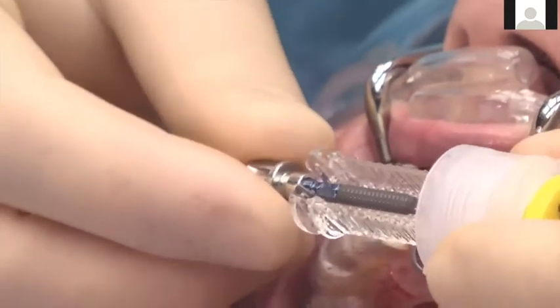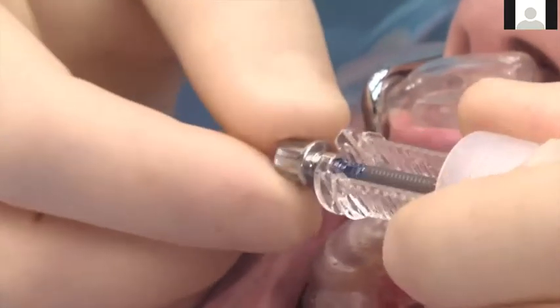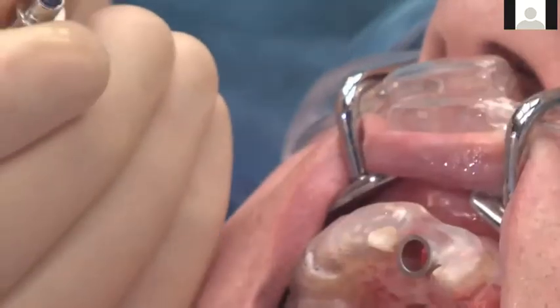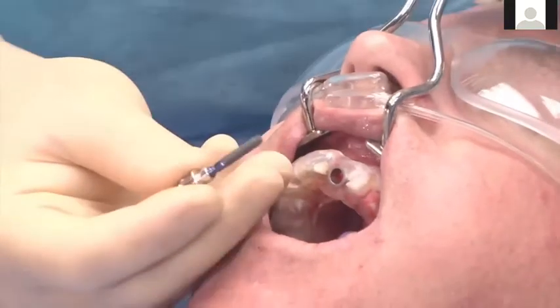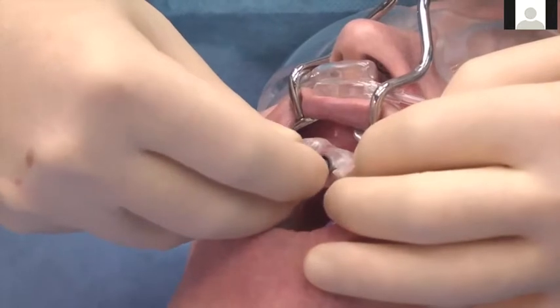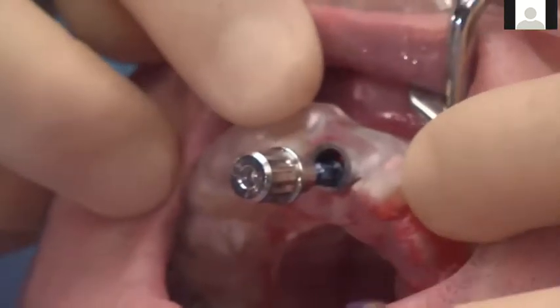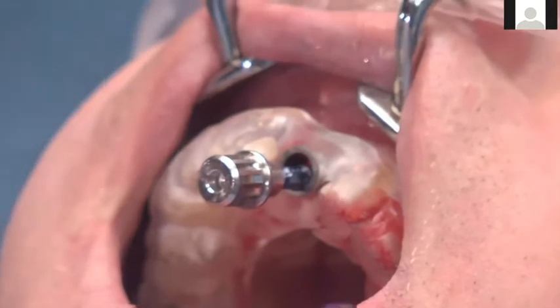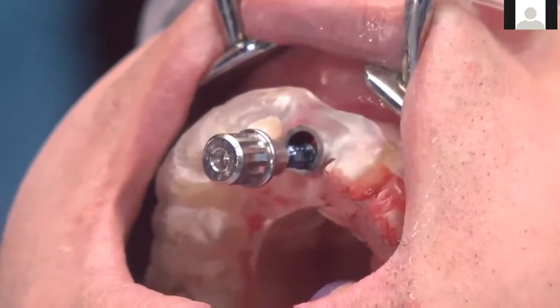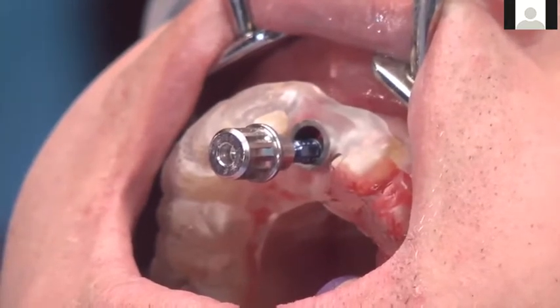Right now, you can put on a regular mount and take this out of its ampule and put it through the guide. Initially, this is obviously non-guided at this point. You can see here, this is just placed into the osteotomy just slightly through the guide. But right now, there's no guidance of that implant placement. So I just turn it in a couple of turns so that it just stabilizes in the osteotomy. And at this point, then we can take this non-guided locks and mount off and go ahead and put a guided mount on. If you do order the guided implants, they come pre-mounted with a guided mount, and you can keep those mounts and reuse them for future surgeries, such as we did in this case.